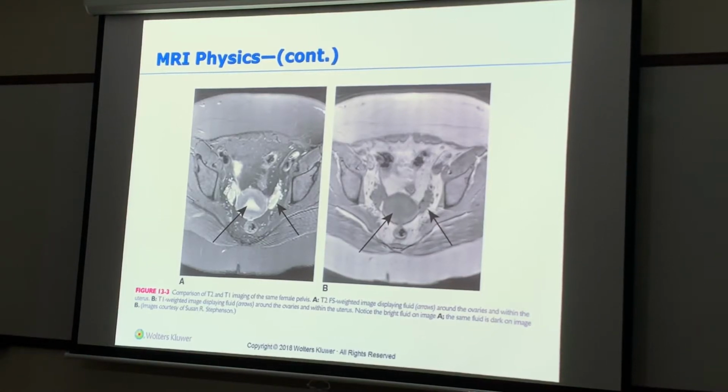Saturation does. It makes the fat look different than the fluid. It's just a button that we push on our machine that lets us control what all is included on that slice. Okay? This is anterior, this is posterior. Now, if I wanted to look at something in my fat wall, in my anterior wall, which one am I going to choose?